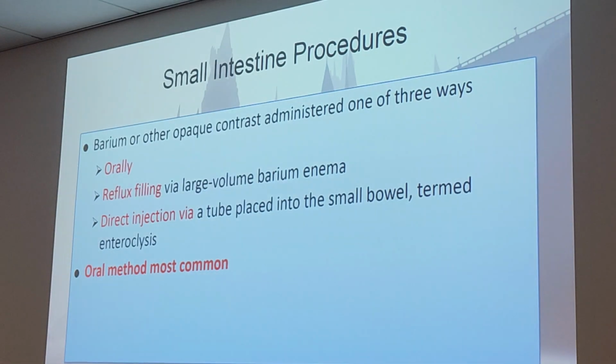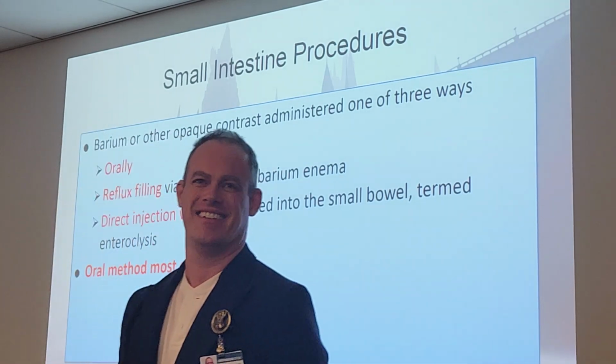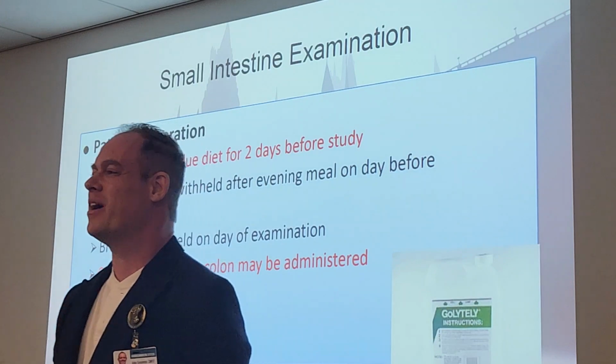Now, good news for this section, guys, there's only one projection. KUBs. That's a little reprieve before we get to the large intestine. All right, so how do you prep for this one?